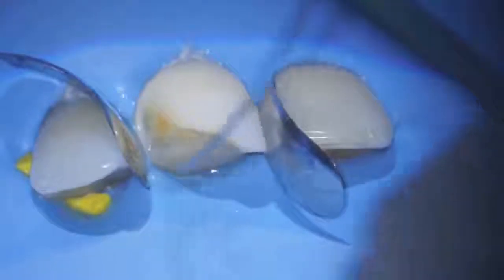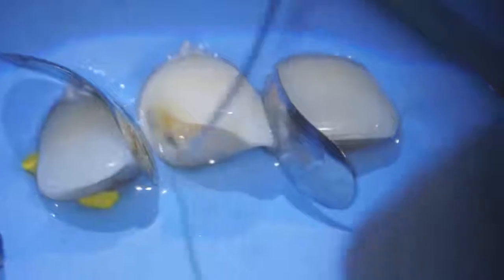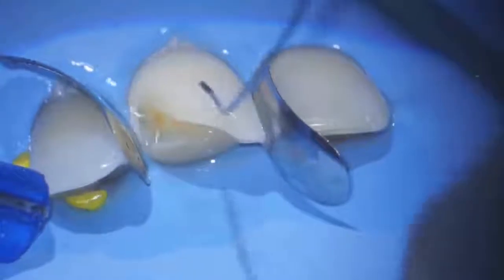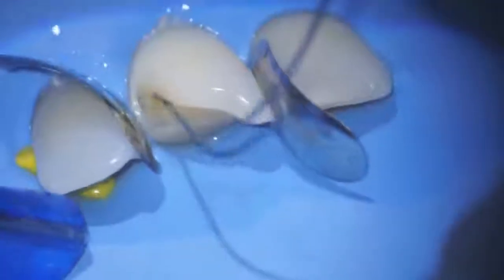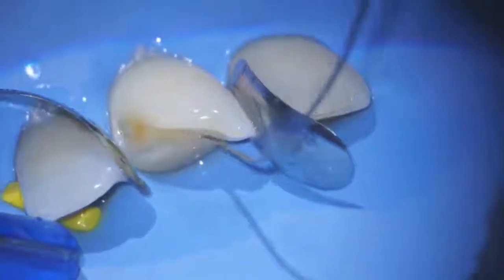So here you can see the stage of ethanol application. Usually I use for all my cases the ethanol bonding protocol with ethanol of 96%. As you can see here, I apply some amount of ethanol directly on dental tissues. The exposure time of ethanol on dentin is around 30-40 seconds.